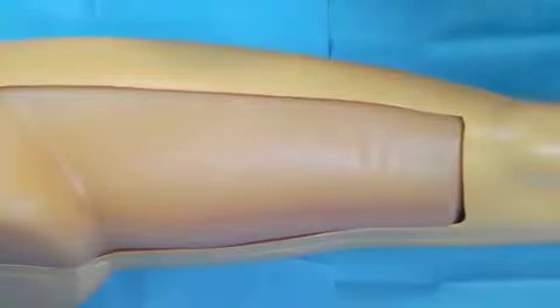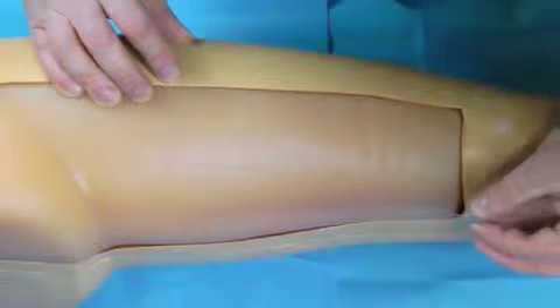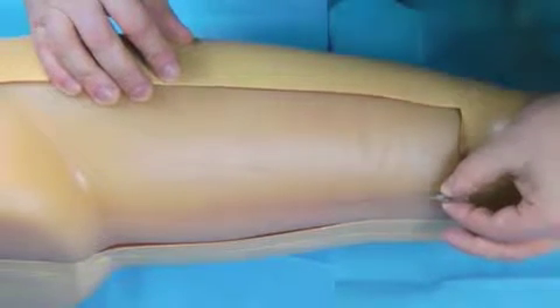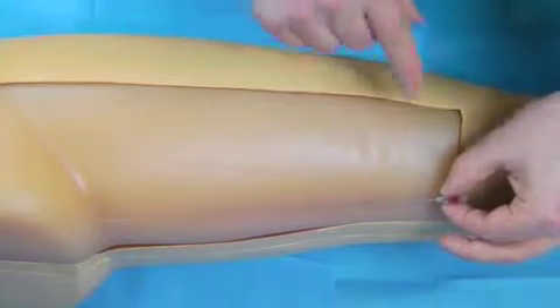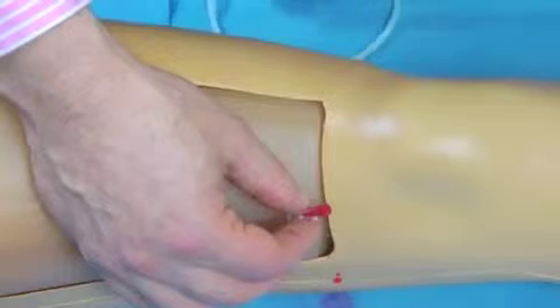I'm now going to demonstrate the endovenous access, and this is using, first of all, the micropuncture needle. So under ultrasound control, what we would do is we would insert this micropuncture needle into the vein, and then we'd use the ultrasound to make sure we were exactly in the right place. Using this model, you can see we've got a flush back, just as we'd see in the normal patient.